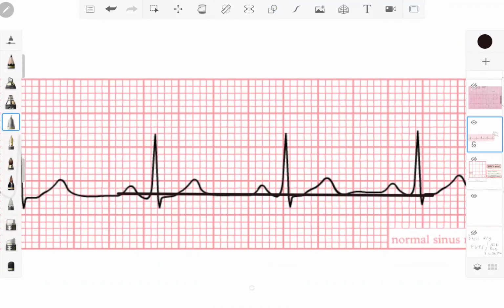This is important because that's where the heart is standing still. So if you see a wave go up like that, it's gone up above the isoelectric line. And when we see a wave like that, it's because the wave has gone below the isoelectric line. That's important.